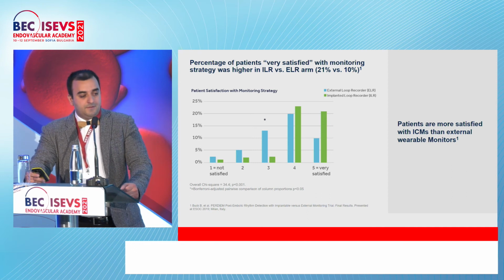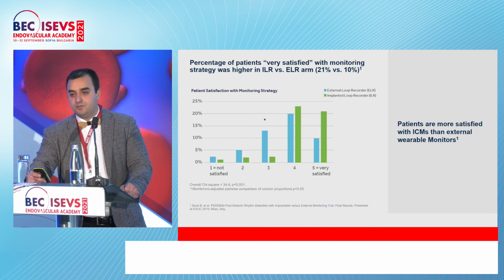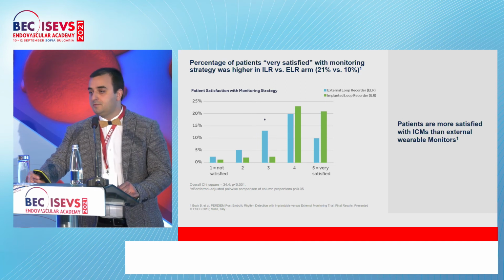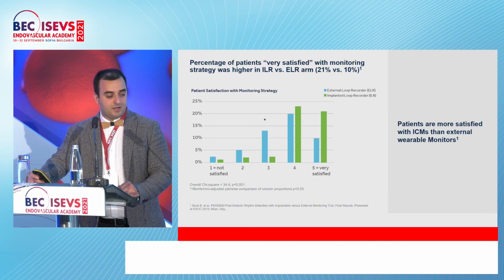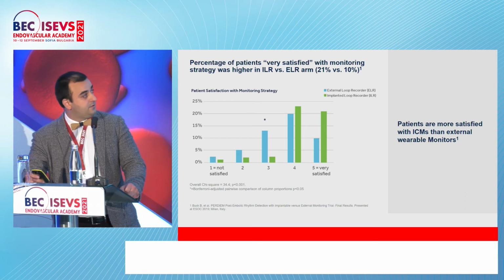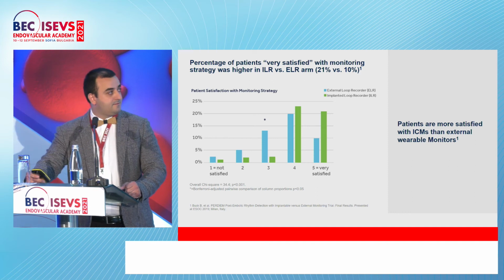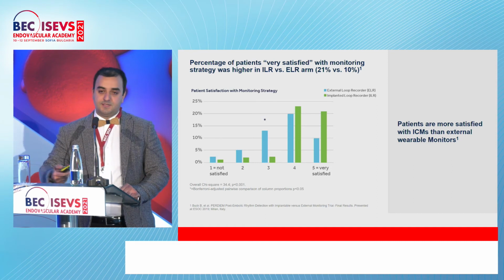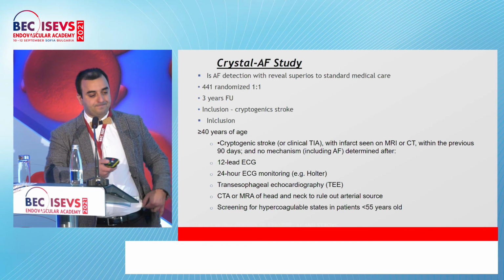What about the patients, how do they feel about this technology? Because it's a small surgery, they're probably not comfortable with this and they refuse such technology. No, we have a small trial, and on the slide you can see that the patients are really satisfied with this technology compared to the patients with external loop recorders. You can see 21% versus 10%, and this is really important to be known.